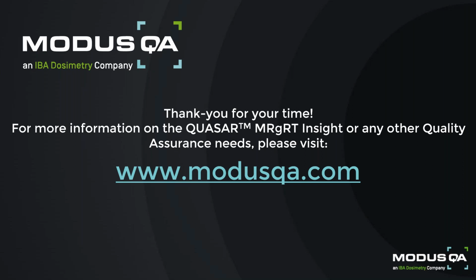And so when you're actually ordering the Insight Solo or dual ion chamber holder, we're going to be asking the physicist to provide information in regards to which ion chambers they currently want to use with the setup or have at their site. Upon receiving that information, we're going to note down what it is and then take that specific ion chamber's dimensions and drawings, no matter which company you use, and then use those to drill the ion chamber opening into the holder to those exact specifications.